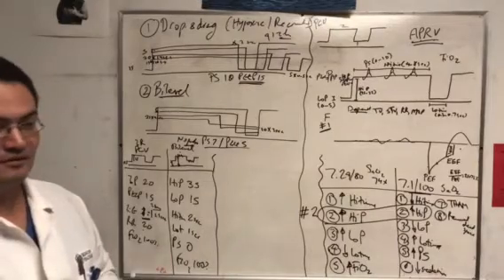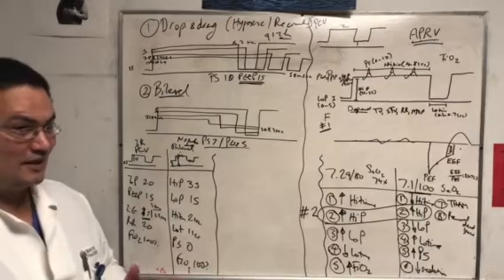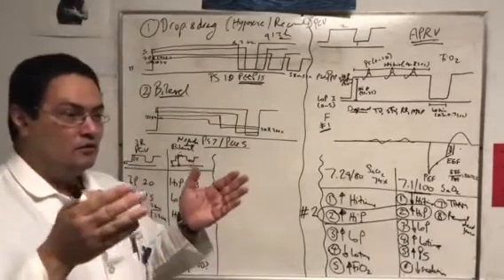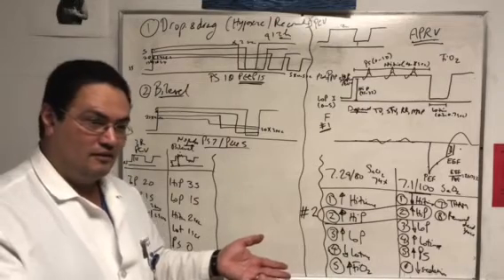No, she'll breathe. Blood pressure. My lungs are fine. And your lungs are fine. What's gonna happen? You will die. I don't care about the barotrauma. We can correct that. You will die. You will have a cardiac arrest. Is it the venous return? Huh? The venous return will drop?